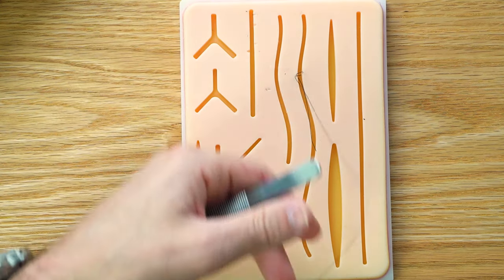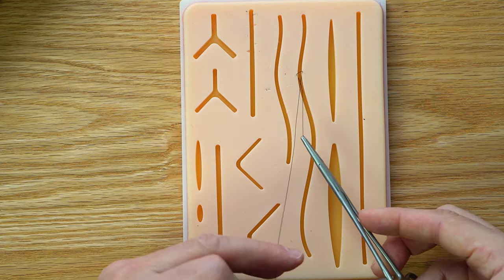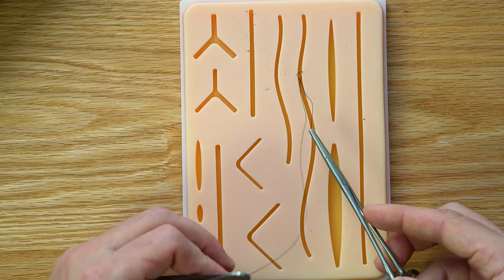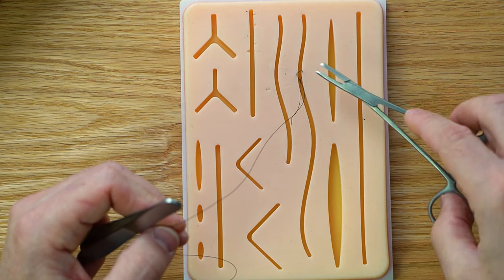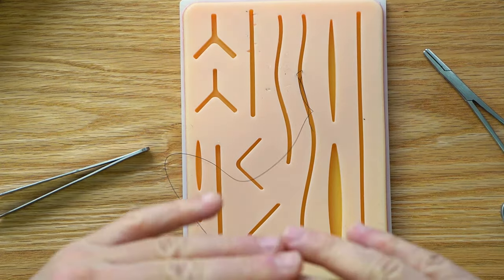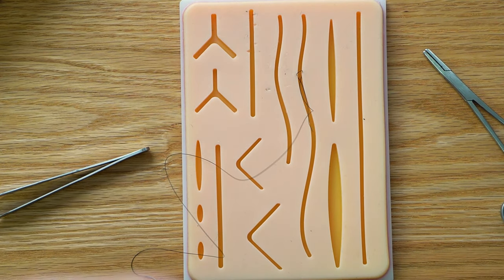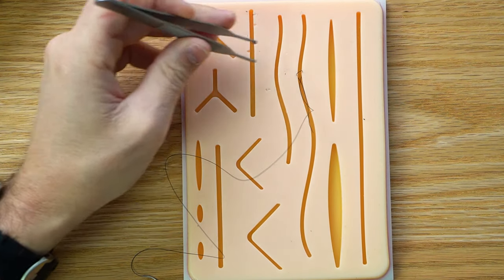But anyway, you need both ends of the suture to come out the same side. This is a big mistake I see a lot of students make: they have one on the other side and then one on this side. When you tie it, the knot depresses the suture, and you want the suture to be on top, pulling the skin together perfectly. You don't want the knot sitting above that suture that's going across there, right?